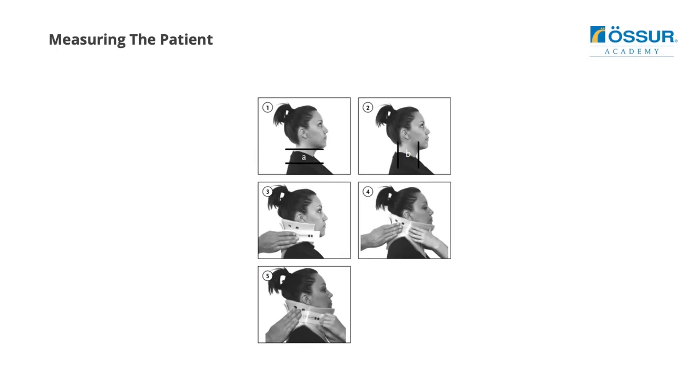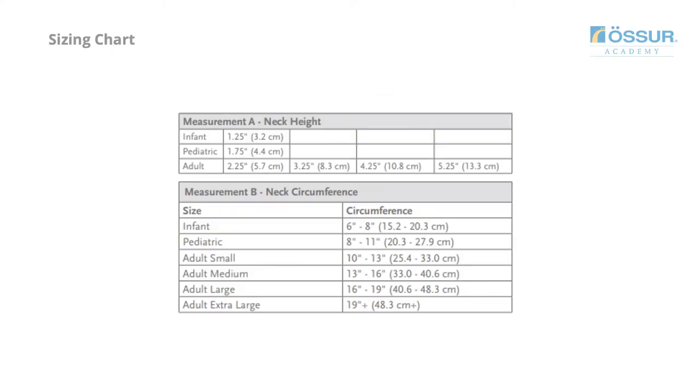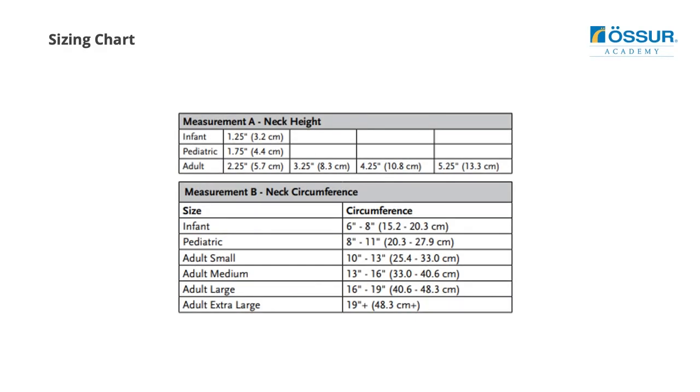Proper sizing is critical to achieve comfort and proper immobilization. Ensure that the correct spinal protocol is followed. To measure the height, measure the vertical distance from the top of the patient's shoulder to the tip of the chin. The measurement corresponds to the height of the device. If the patient's measurement falls between two consecutive sizes, apply the smaller size first.